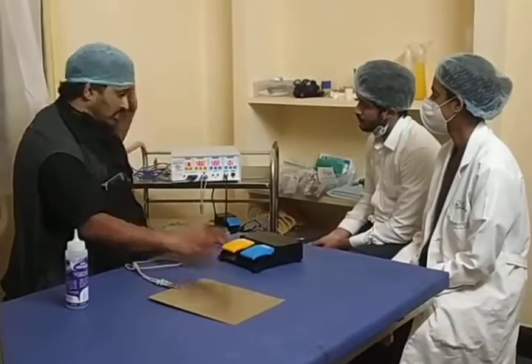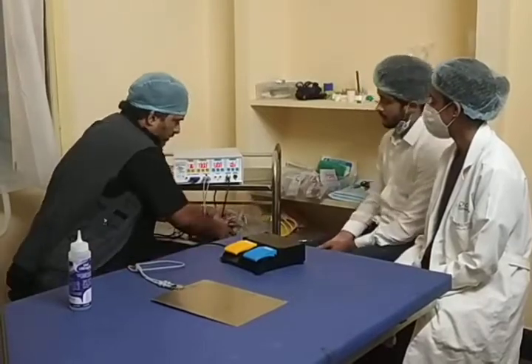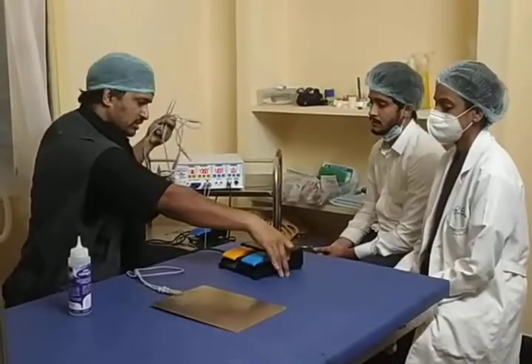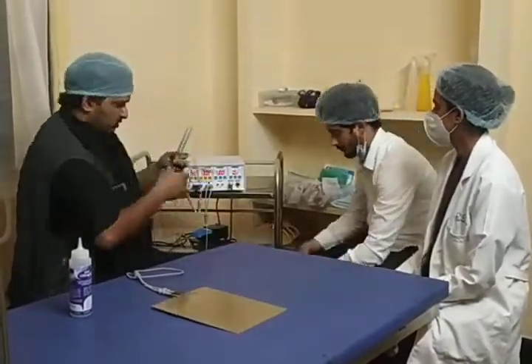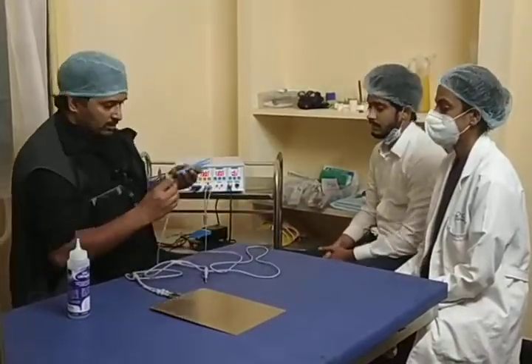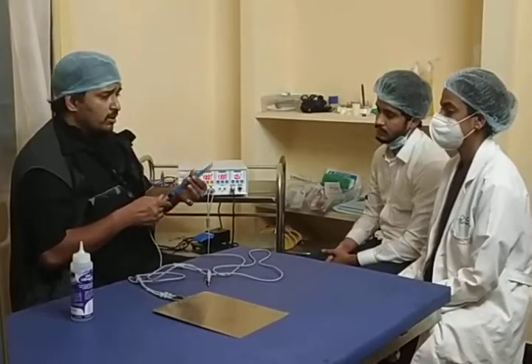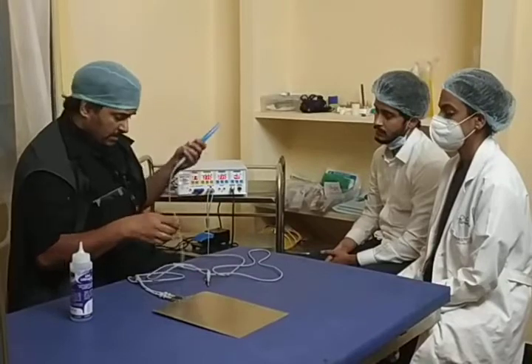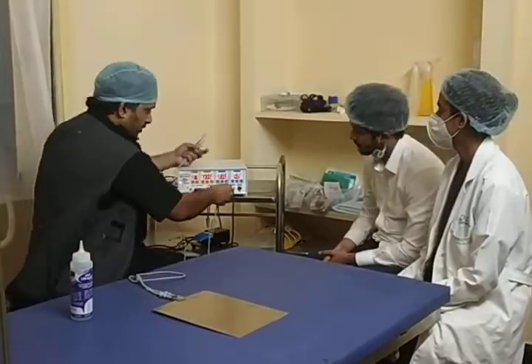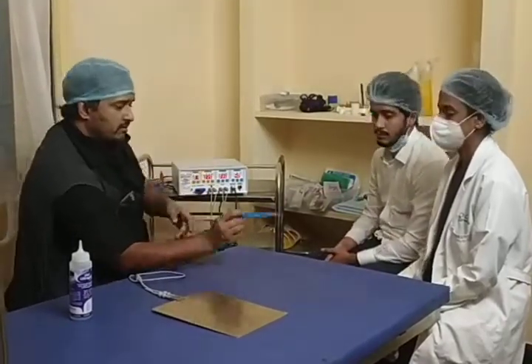Now let's see if we have the bipolar option. Now the bipolar also, we have options over here. If you see, this is the switch for bipolar. I'm going to remove this out of our sight at the moment. You can keep it turned off. Okay, so this is the bipolar option. There is a provision over here. So this is the bipolar setting over here. This is the probe where you can cut and coagulate at the same time. And then this is the setting over here for bipolar. So I connect it over here. I connect it over here.